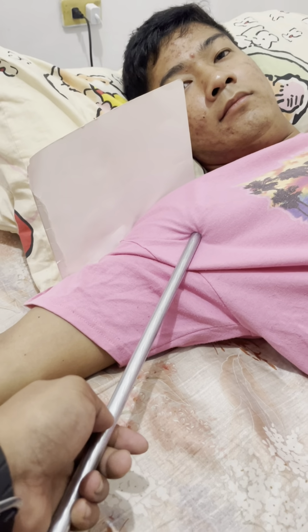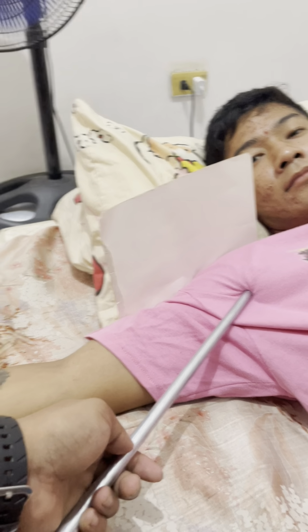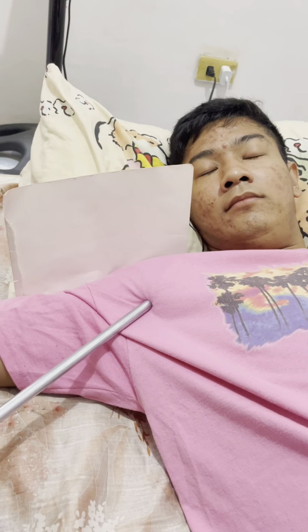Projection is infero-superior axial projection Lorentz method. CR and IR is directed 15 degrees towards the shoulder through the axilla. So, directed 15 degrees papunta sa shoulder.